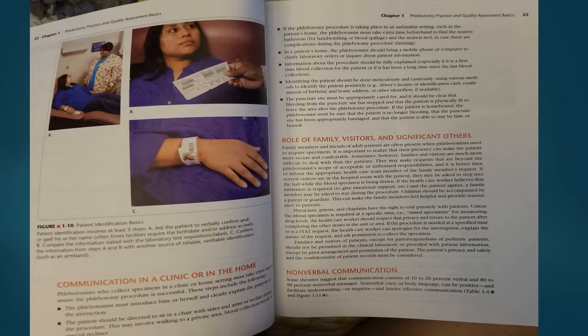If the phlebotomy procedure is taking place in an unfamiliar setting, such as a patient's home, the phlebotomist must take extra time beforehand to find the nearest bathroom for hand washing or blood spillage, and the nearest bed in case there are complications during the phlebotomy procedure, such as fainting. In a patient's home, the phlebotomist should bring a mobile phone or computer to clarify laboratory orders or inquire about patient information. Information about the procedure should be fully explained, especially if it is a first-time blood collection for the patient or if it has been a long time since the last blood collection.